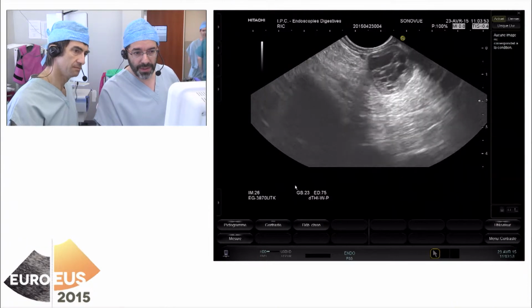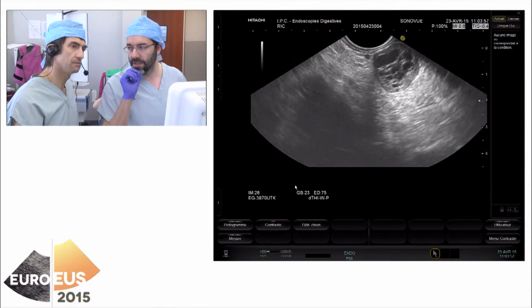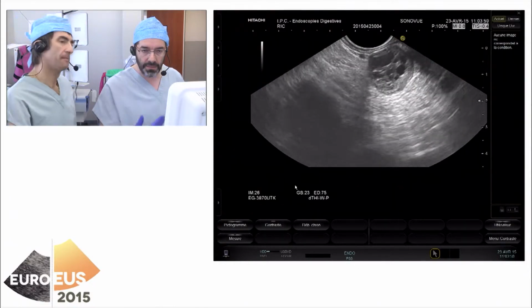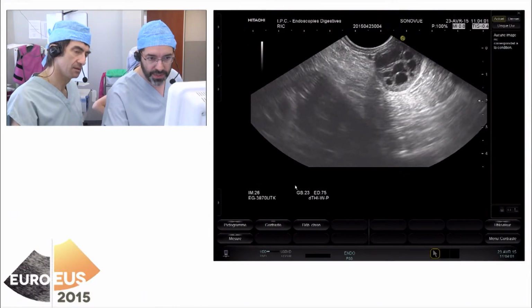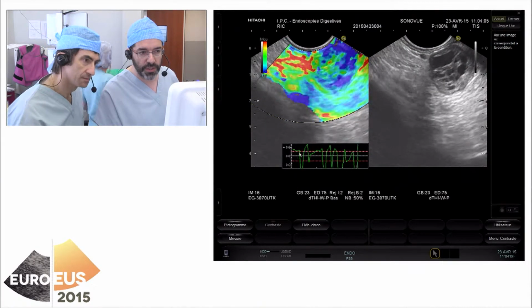We've also, I think, in these cases, although elastography can sometimes be difficult whenever you have some cystic component, because it may misinterpret the image. But I think it's also important to take a look, and you see in the upper part of the lesion.